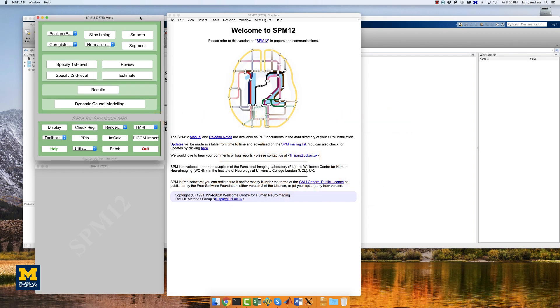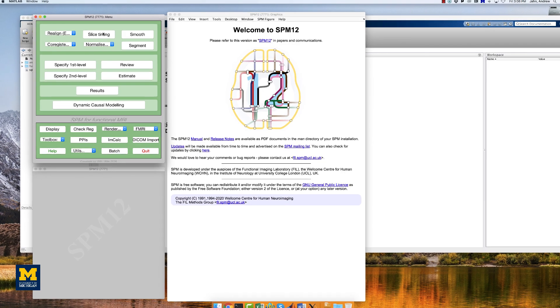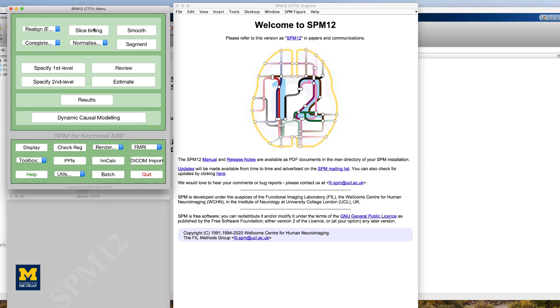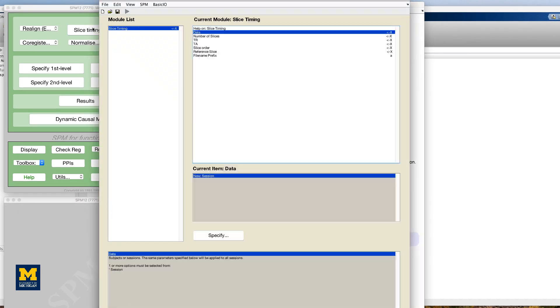The next step is slice timing correction, which edits the data to make it look as though all of the slices were acquired simultaneously. Similar to what we did with realignment, we will first click on the slice timing button in the SPM GUI.